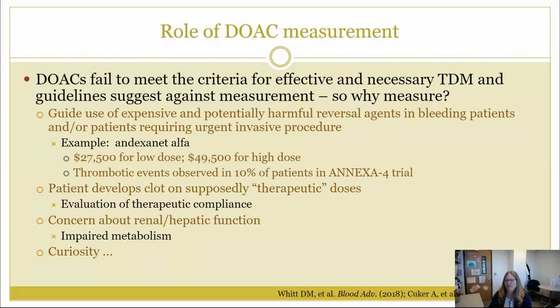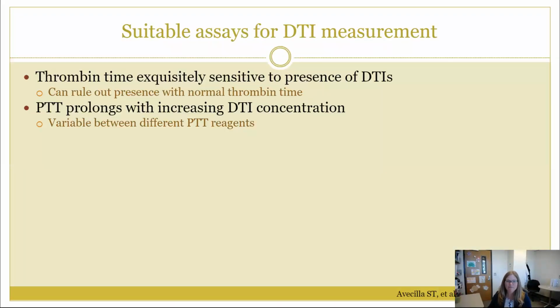And so these might be reasons why you might be asked to measure or have assays available for measuring DOACs within your laboratory. I will say at this point, though, that measurement and monitoring are not the same thing. Monitoring implies that you have a measurement and then you will adjust the dosing based on that measurement, which is not what we will be talking about. We will be talking about having assays available for measurement to guide these different clinical actions.